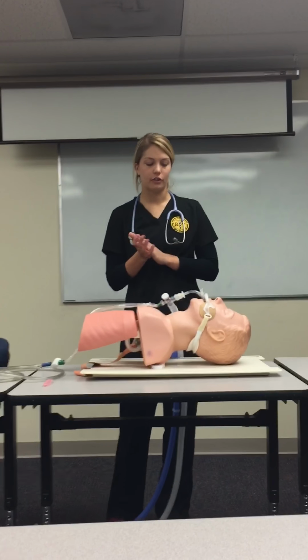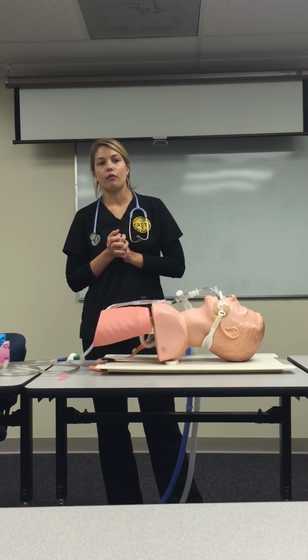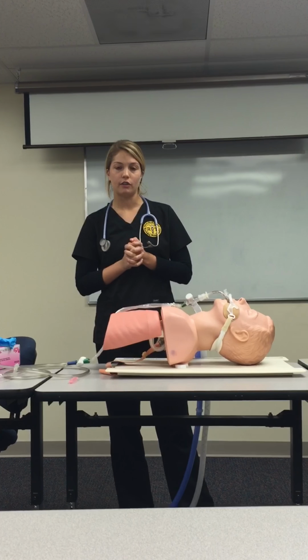I'm going to show you how to suction a patient. So the first thing I'm going to do is look at my patient's chart, look for indications for suctioning, his history, and see how he previously tolerated the treatment.